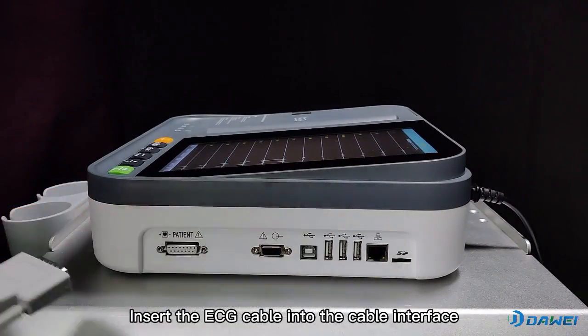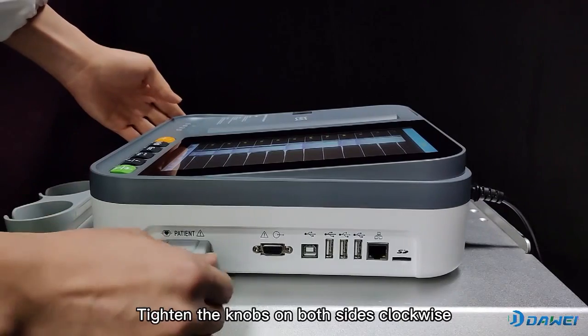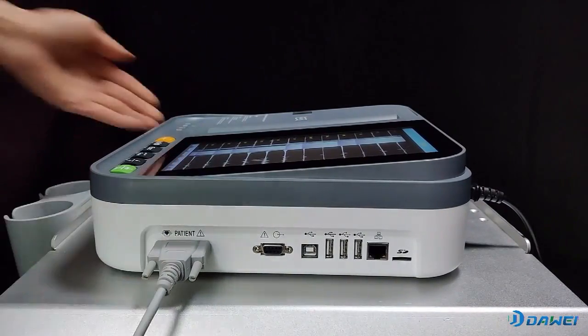Insert the ECG cable into the cable interface. Tighten the knobs on both sides clockwise. Insert complete.